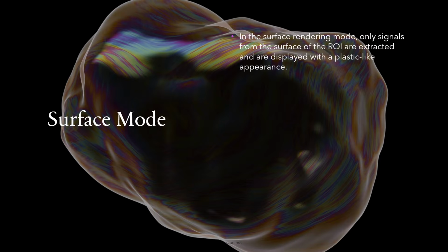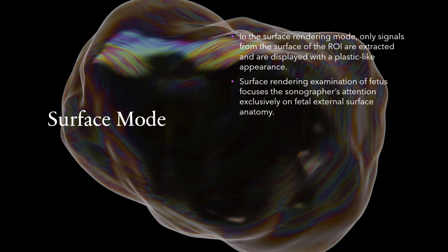When applied to fetal imaging, surface rendering focuses solely on the external surface anatomy of the fetus. This is ideal for examining facial features, limbs, and body contours, providing a clear and detailed view of the fetus' external appearance. It allows clinicians to assess the overall development and look for any external anomalies.